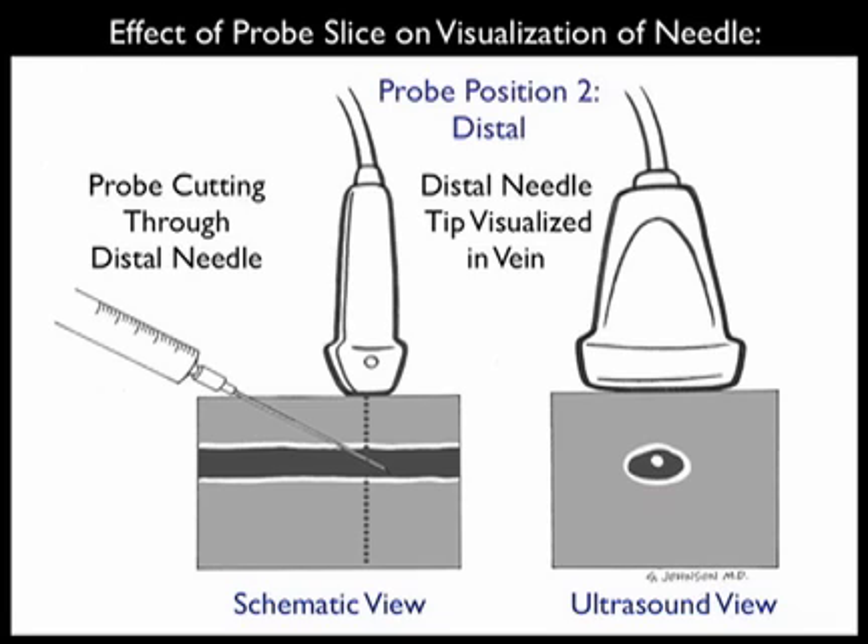In order to accurately determine the location of the needle tip, we need to move the probe more distally as we advance the needle into the patient's neck along the course of the vessel. Here we see the probe positioned more distally, now in plane with the needle tip in the schematic view towards the left. There we can get an accurate determination of the location of the needle tip with regard to the venous lumen. In the ultrasound view towards the right, we'll be able to see the echogenic tip of the needle accurately positioned within the vessel lumen.